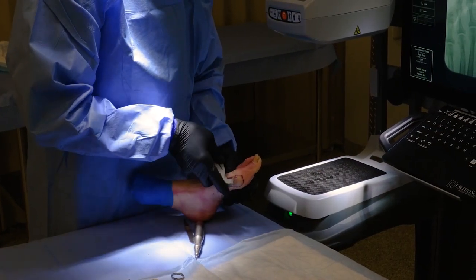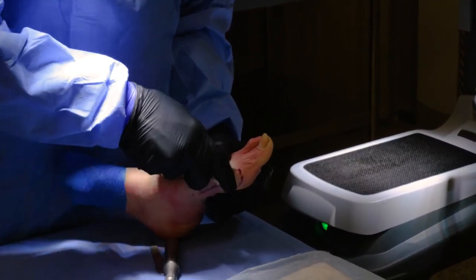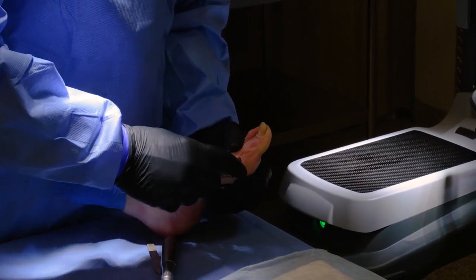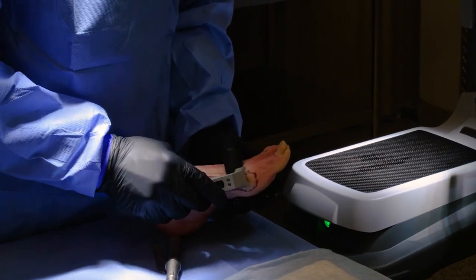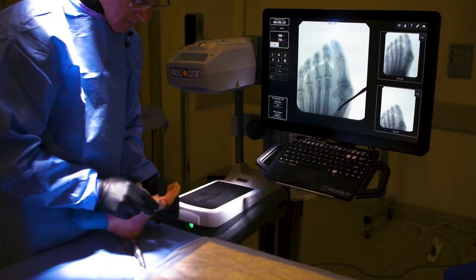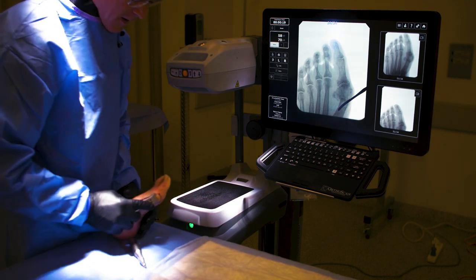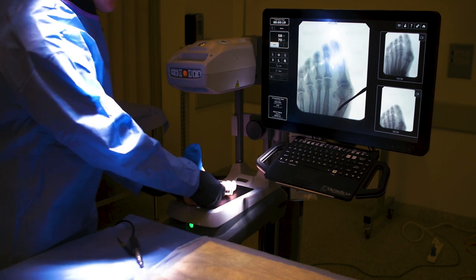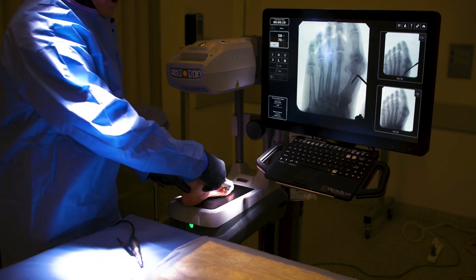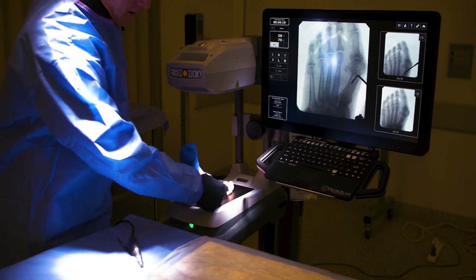I need to get into the bone — the first time you do it may be a little bit tricky but you'll get used to feeling something go into the medullary canal. That's also why I went in with my freer first. I think I'm in bone; if I'm not sure I could take a look. If they have a big medial eminence it's sometimes a little harder. I'm in bone, I'm where I need to be — I came a little bit higher up so I'm not fighting the medial soft tissues.